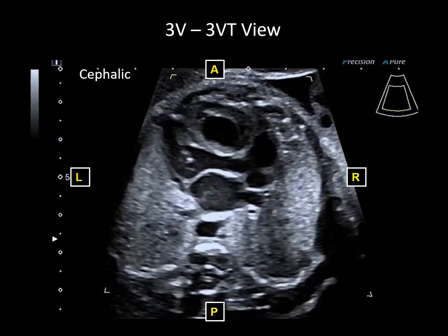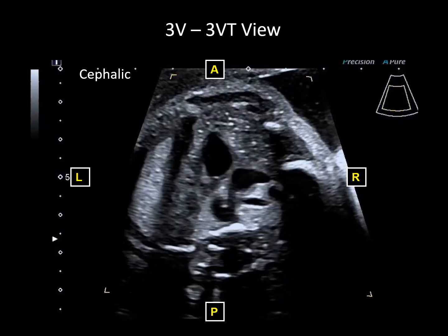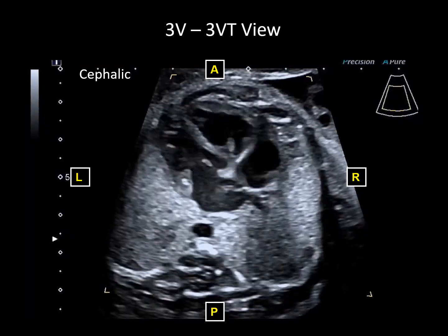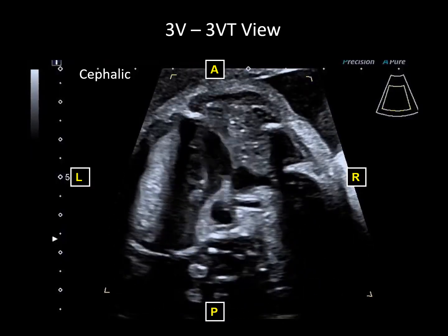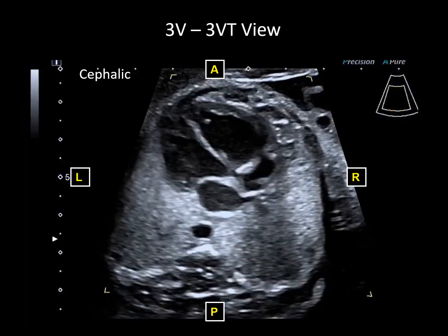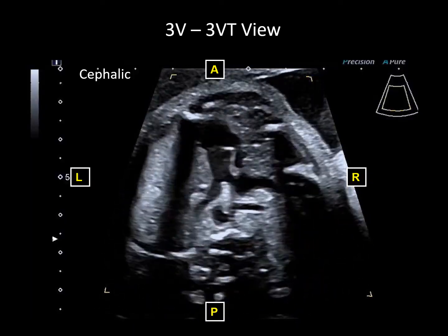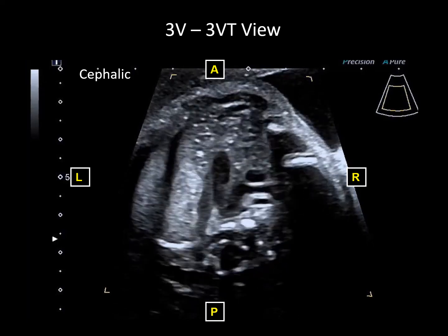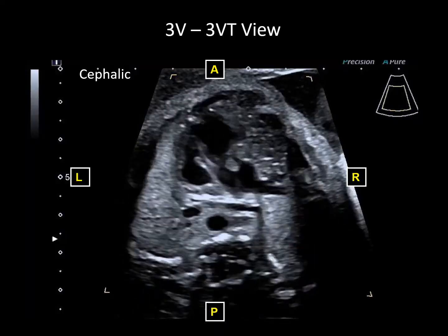This particular view shows how we go from the 4-chamber view to the outflow tracts and then up to the 3-vessel view there and transition to the V of the ductal and aortic arches at the end of the scan. There's a lot going on here, and if you imagine acquiring this in a 5-second clip or cine clip, you can see everything within the chest, including the lungs.